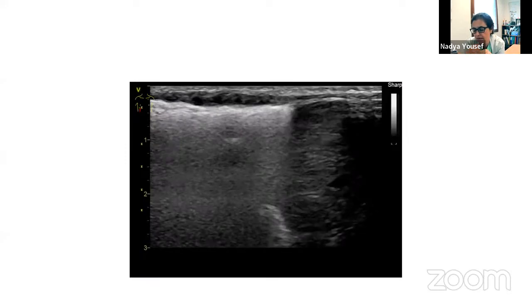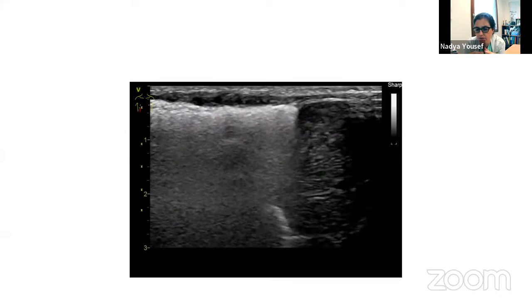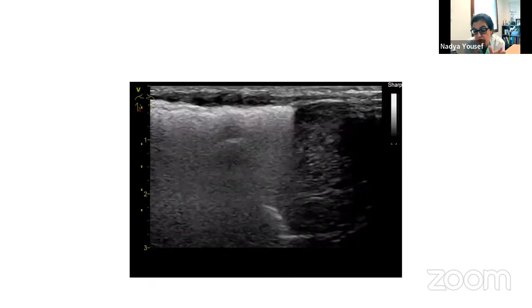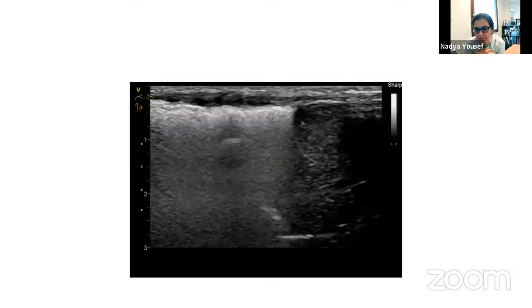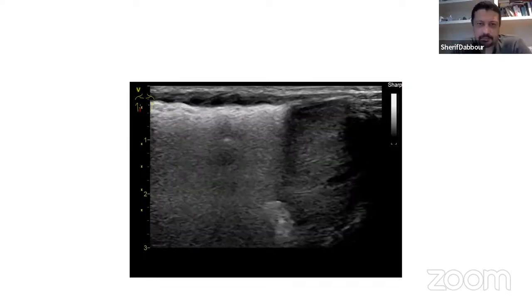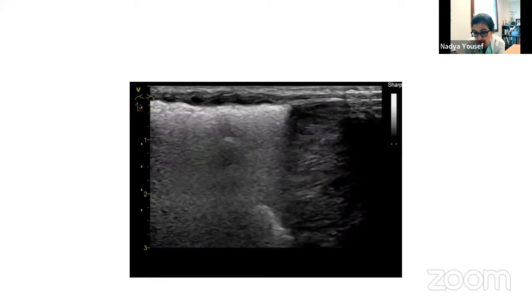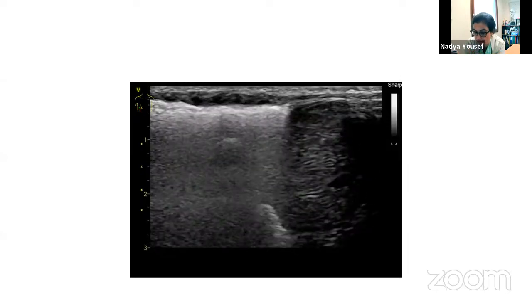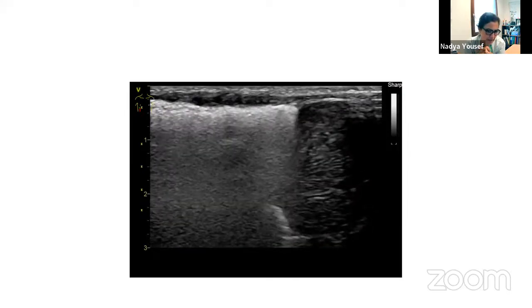In adults, maybe less than 10%, or maybe 10% of, for example, pneumonias are not in contact with the pleural line. In children, this has not really been shown, but who knows? Maybe there's a tiny percentage, and in the newborn, even less so. So the probability that we miss something is there. It's much less than in an adult, but if you did have something, you would have to be able to see it and it would have to be in contact with the pleural line. If it's small or much deeper, you want to go further down. And changing the frequency here would not really help you that much.